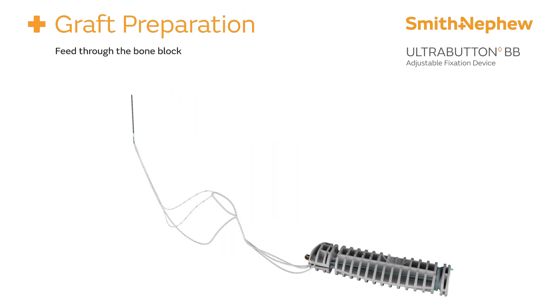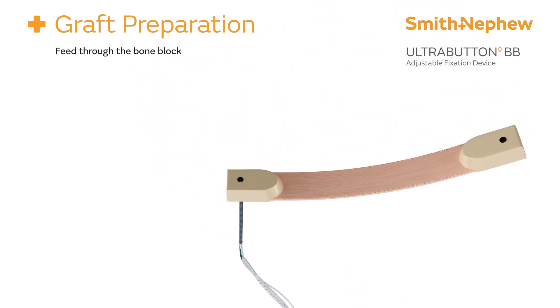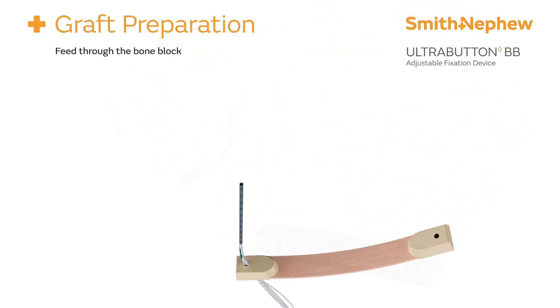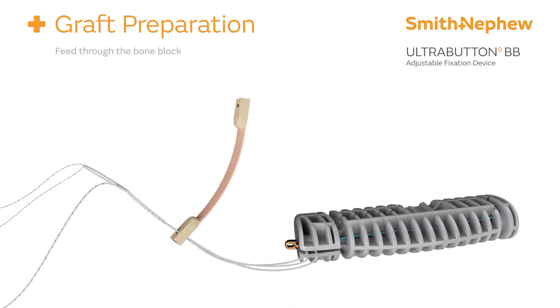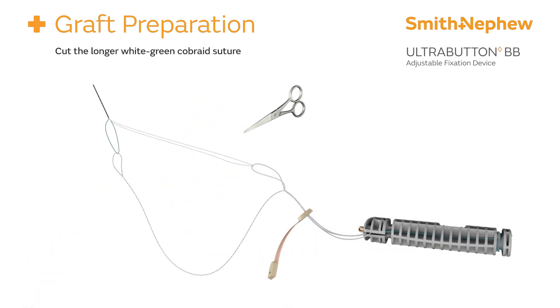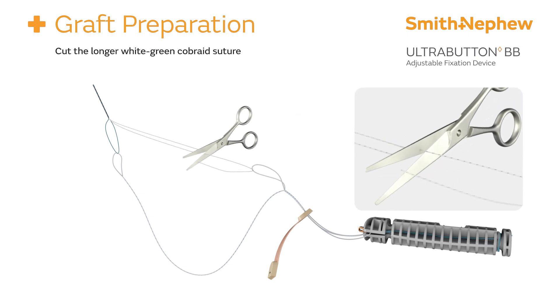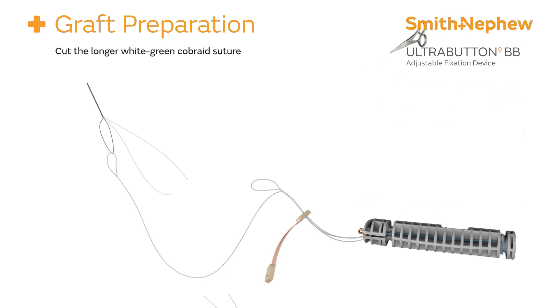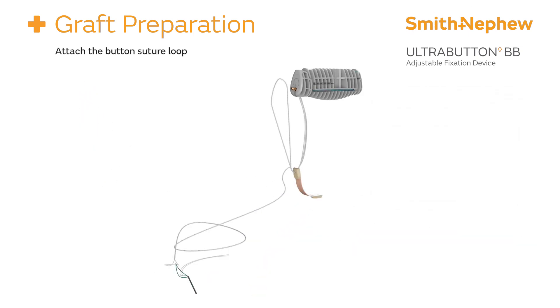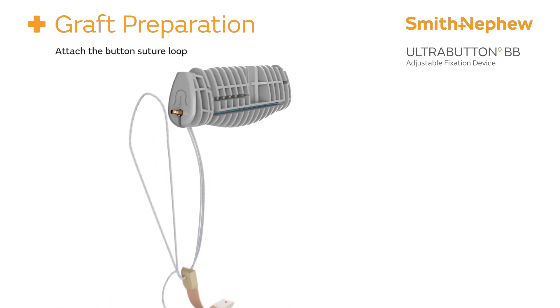Feed the suture passer through the bone block and advance the graft until it is close to the reduction bar. Then identify and cut the white-green suture attached to the suture passer — this will release a loop of white-blue co-braid button suture.